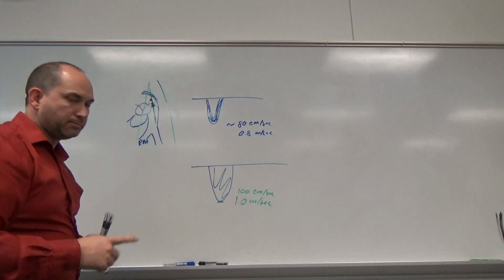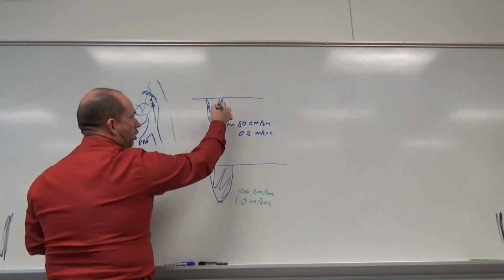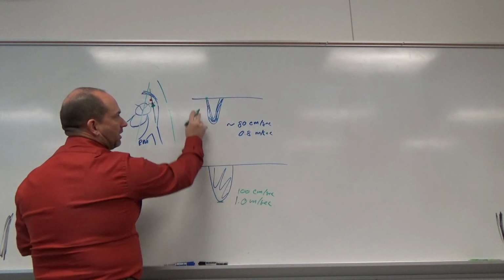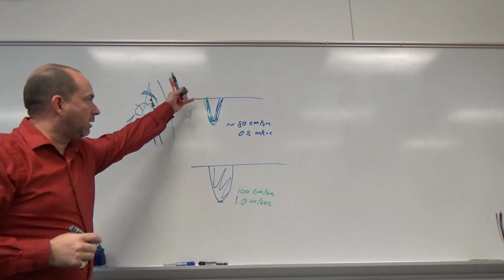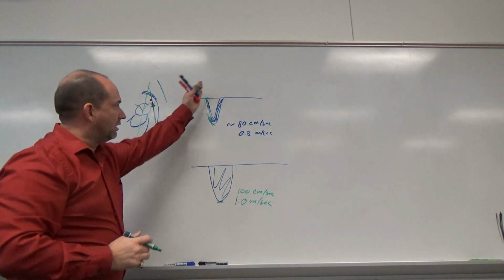Okay, so we measure that. I did forget to mention, just like the last one we did on the long axis, this is now short axis of the same thing. Put a caliper at the baseline where that wave starts, put it at its peak. We're looking at the slope. How much time does it take from the beginning of this to there?